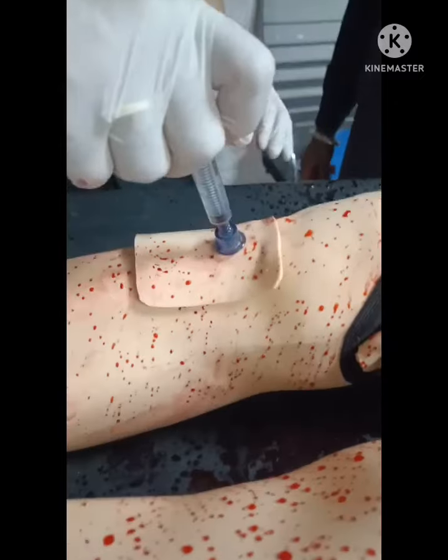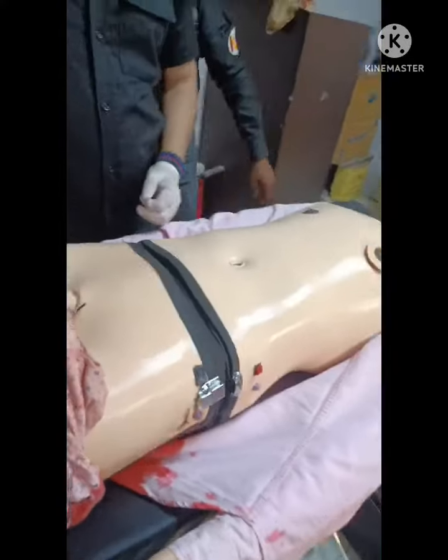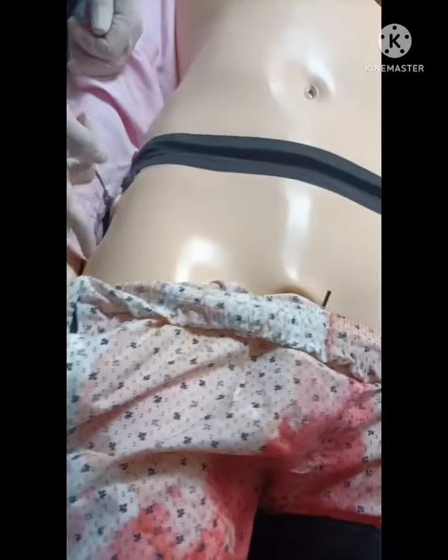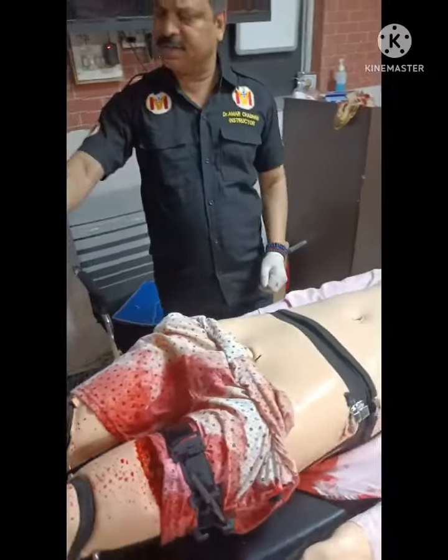So this is the IO access we have given, and then you can apply a pelvic binder also. They show the greater trochanter, and this is the place where you should apply the pelvic binder.